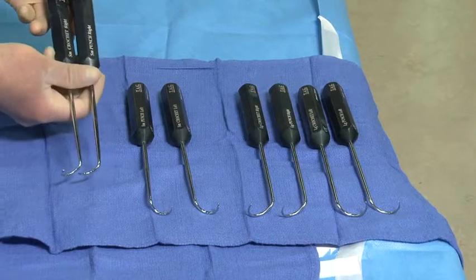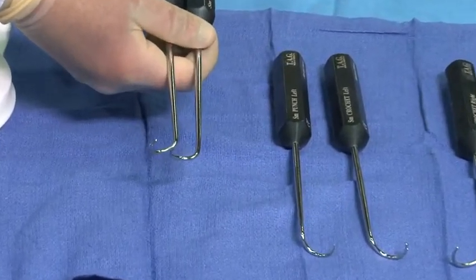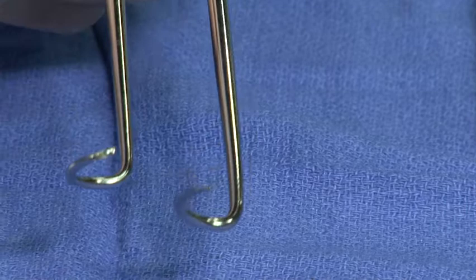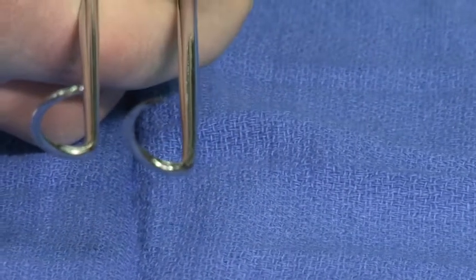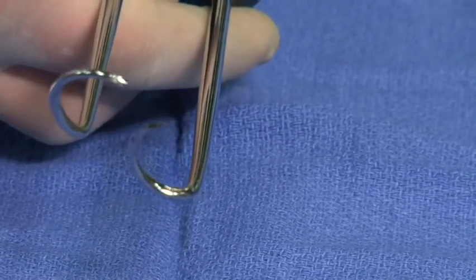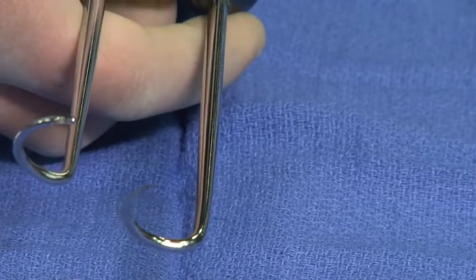If we focus on the tips of the devices we see that the radius of curvature for the hook, which is on the right side of the screen, matches the radius of curvature for the crochet, which is on the left side of the screen. And because of that, as the suture is passed through the bone with the crochet hook it matches the position of the tunnel that's been created.